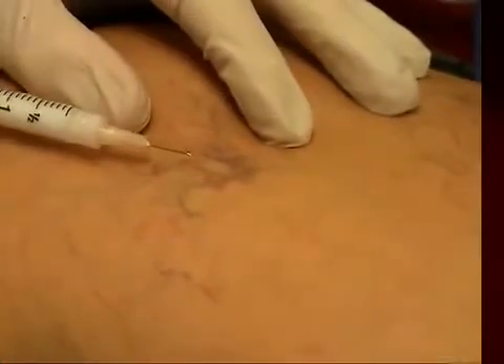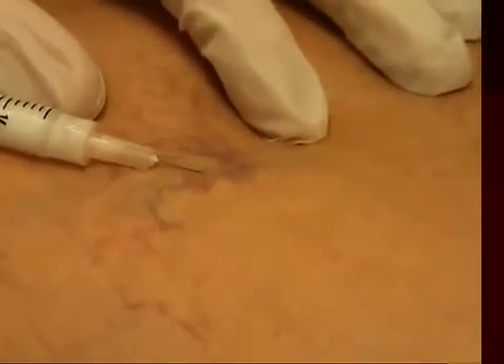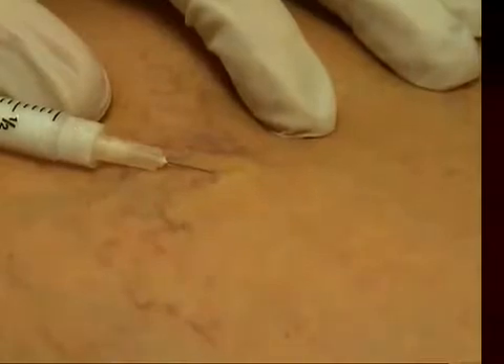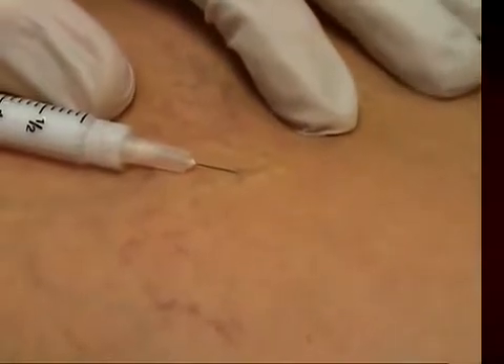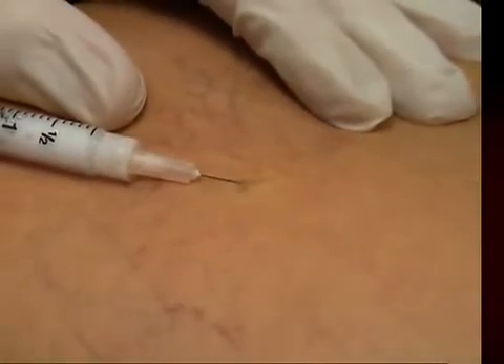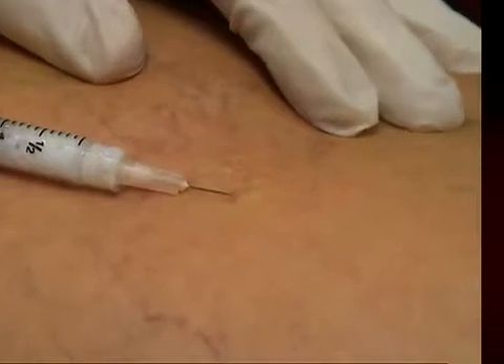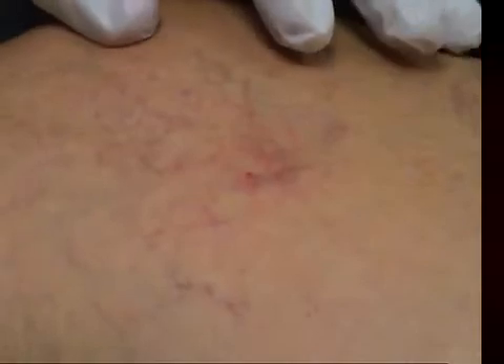Gentle pressure here. This is foam sotradecol, 0.1%. Now this goes in more slowly and does not reach quite as far as the regular sclerosing agent, but it hangs around for a long time. See how that hangs around — you can just see it refilling now centrally, but still a lot of this has not refilled. I squeezed it right there and it came back more quickly.